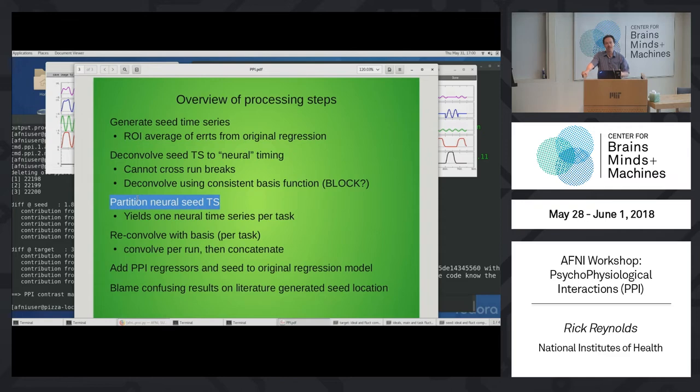Optimally, you might even think right now, well, shouldn't we do all of our analysis like that? Wouldn't we actually like to deconvolve our whole 4D time series and run our linear regression model? Then we could just do the whole analysis like this. That might even be reason one, if we could deconvolve well. And two, the cost is that it would take a long time. Deconvolution is an expensive step. It takes a lot of computation. It's easy to do it in one voxel modestly quickly, but to do it on 100,000 takes a long time.